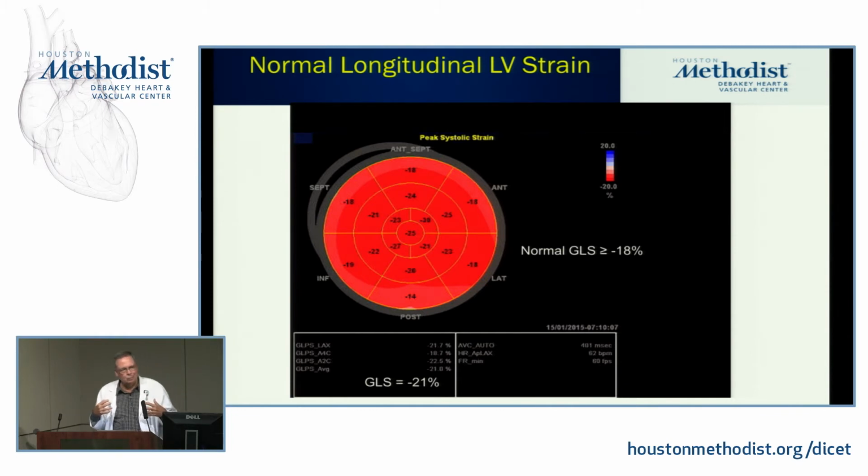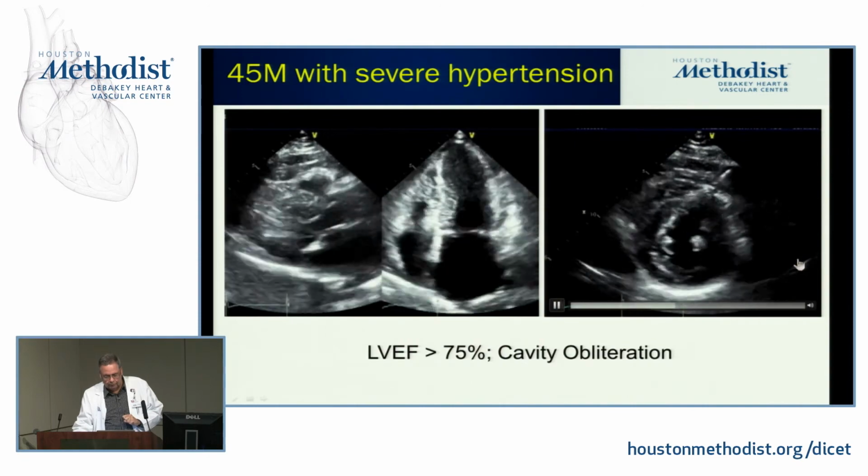Some people are arguing maybe minus 16. On the new Philips I'm seeing a lot of 16%, when on another machine the same patient had a 20, because the patient was done twice. So we're still struggling a little bit as to what is the magic border of normality in a GE, a Philips, a new Philips, and now we have a bunch of Toshibas. That's one of the things that we still have to define.